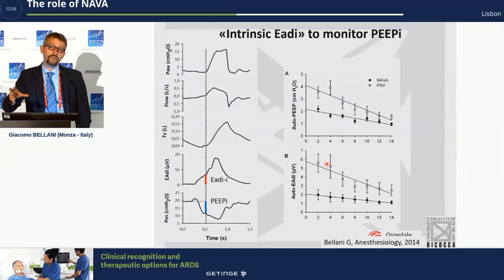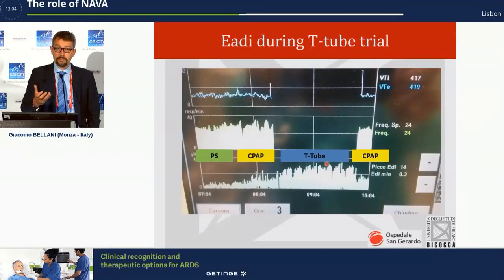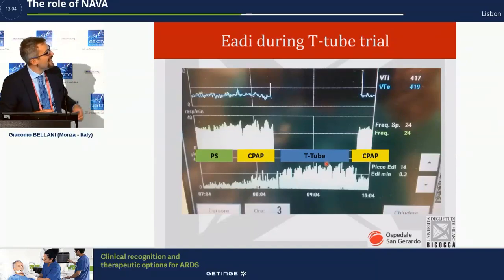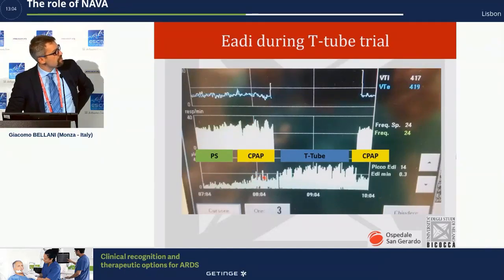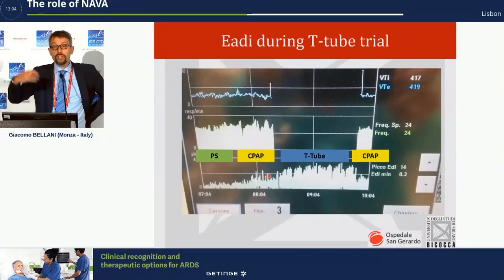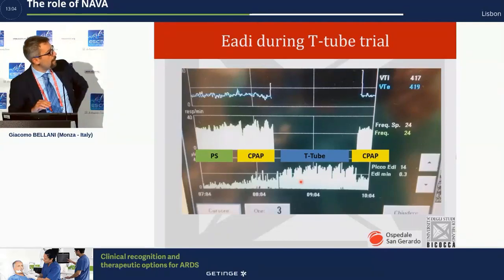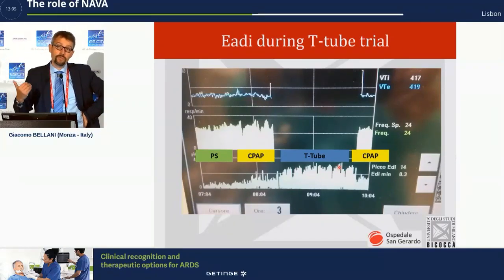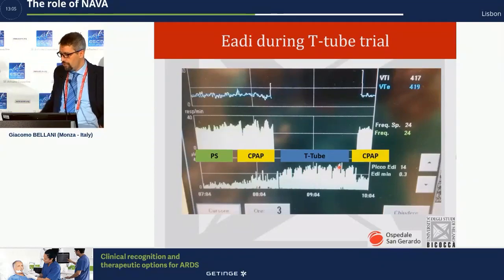Let me show you one more monitoring example. This is pressure support ventilation during weaning. We remove the pressure support, put the patient on CPAP — tidal volume and respiratory rate don't change, so we're happy. We switch to T-tube, disconnect the ventilator, but keep the monitoring in place. I'm no longer happy: as soon as I remove PEEP, the EDI is now more than twice what it was before. There are many possible diagnoses, but this just illustrates how powerful this monitoring tool can be.